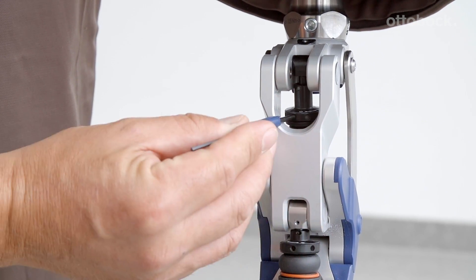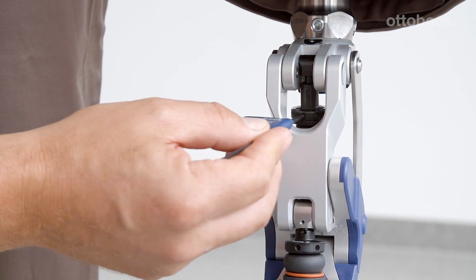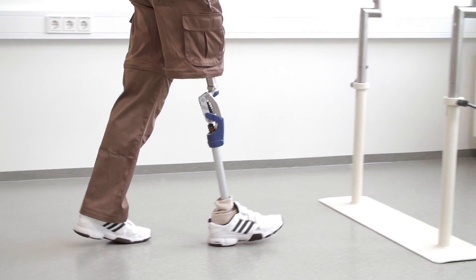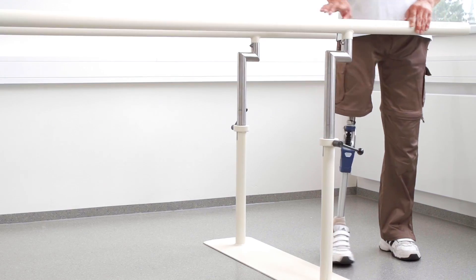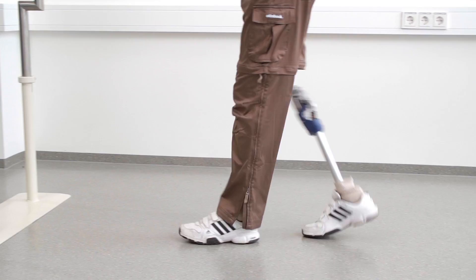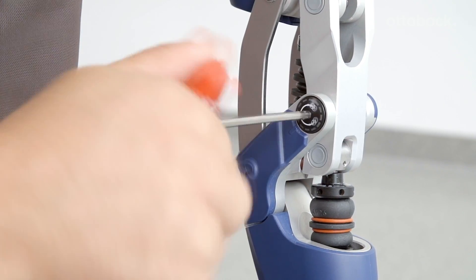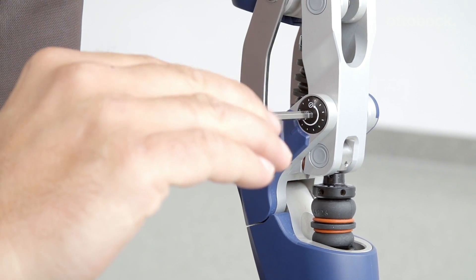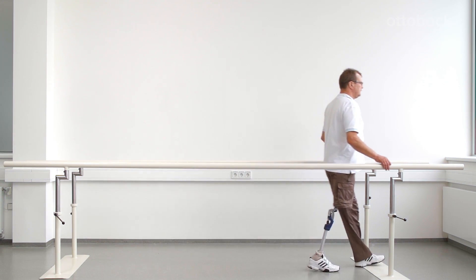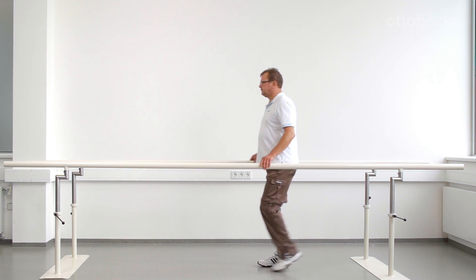During swing phase, the spring effect of the extension assist prevents the knee from flexing too much. The extension assist is adjusted by turning the upper adjustment ring. A spring tension that is too tight will cause the knee to flex too little and the shank will swing forward too quickly, resulting in a hard extension stop. When adjusting the swing phase, remember that the extension assist and swing phase friction influence each other. Ensure that swing phase friction is increased only in small increments; otherwise, the knee joint may not reach full extension due to high friction at the axis, and heel strike will occur with a flexed knee.